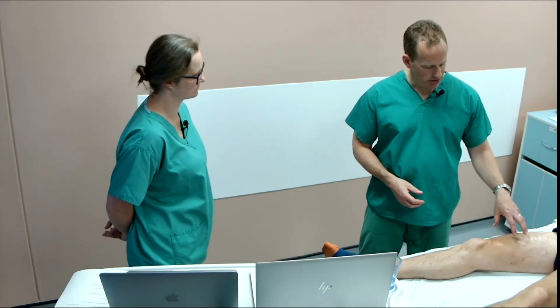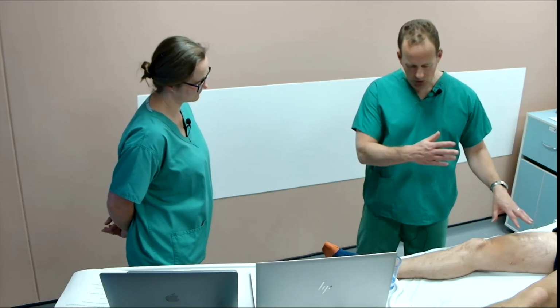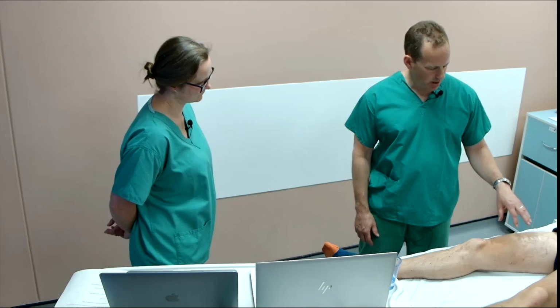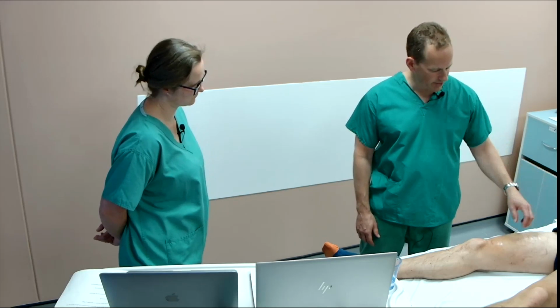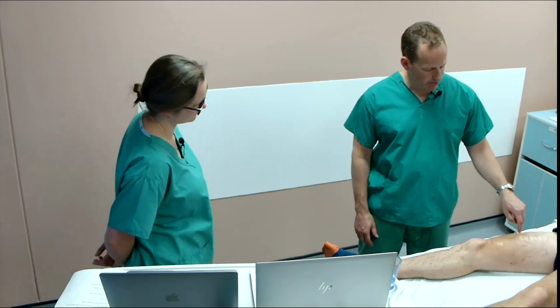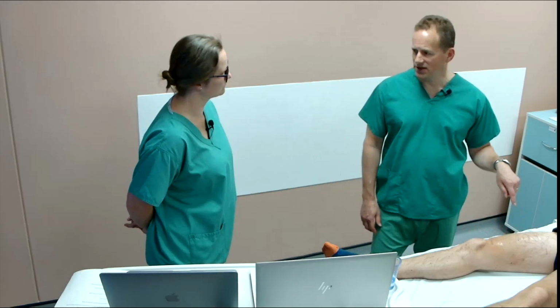The other practical issues, we did try and put some in a while back, long before we were putting femoral triangle catheters, femoral nerve catheters in, and we were doing a little comparison with adductor canal catheters. They're difficult. So if a single shot adductor canal block is difficult, these are much more tricky.